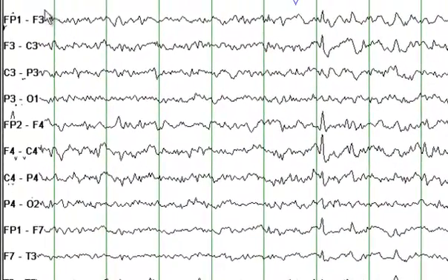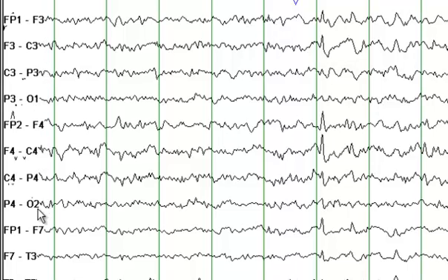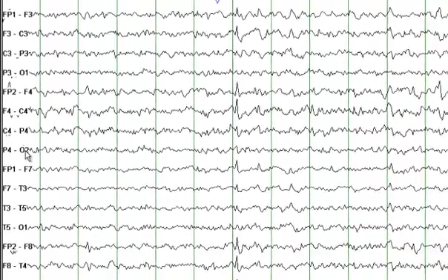On this introductory page, you see a bipolar longitudinal montage. All the odd numbers represent electrical activity from the left hemisphere. All the even numbers represent electrical activity from the right hemisphere.